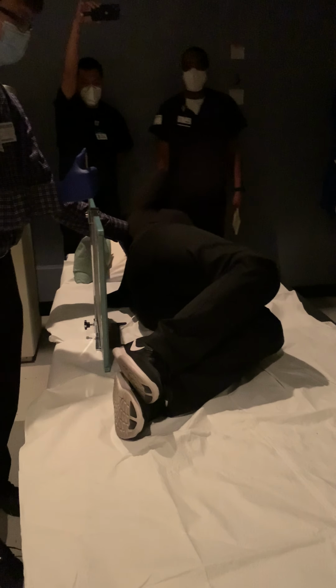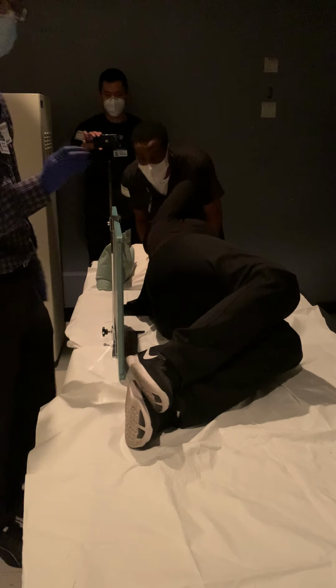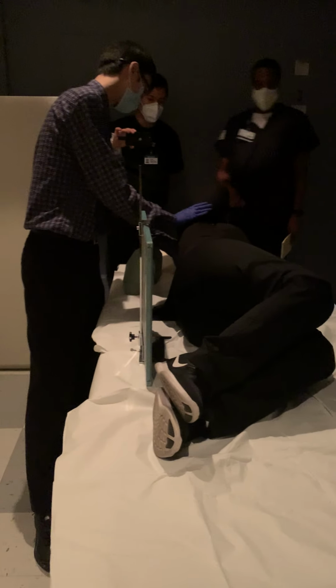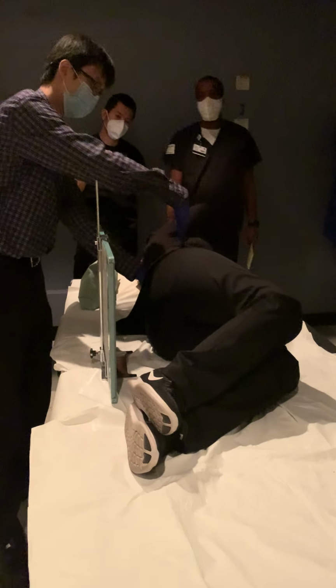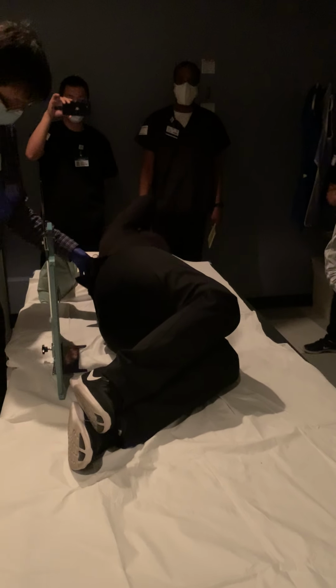Is this patient straight? Is this MCP straight? Is there rotation? Shoulders are rotated indeed. Okay, turn. Good. Turn your hips as well. Good. All right. How does that MCP look? It looks straight? Looks flat. Okay, good.